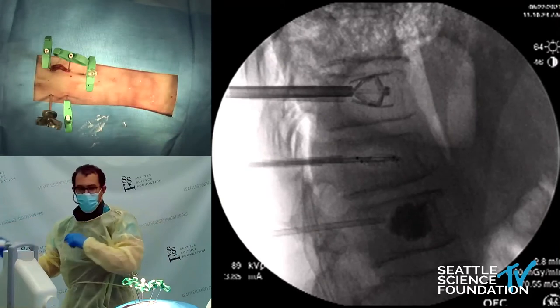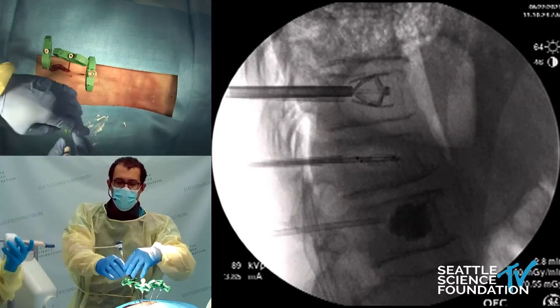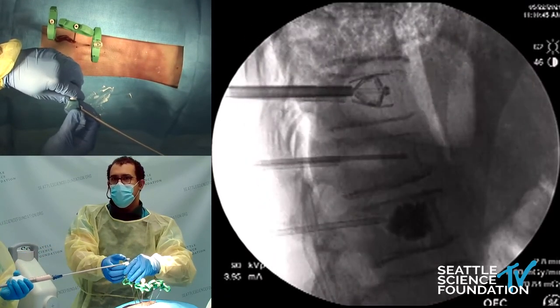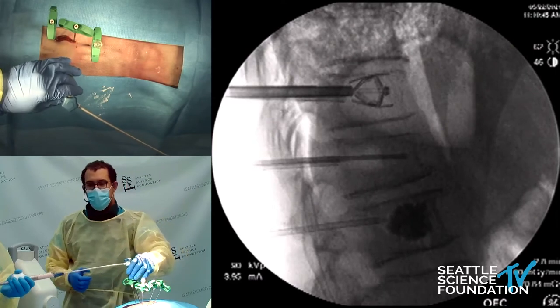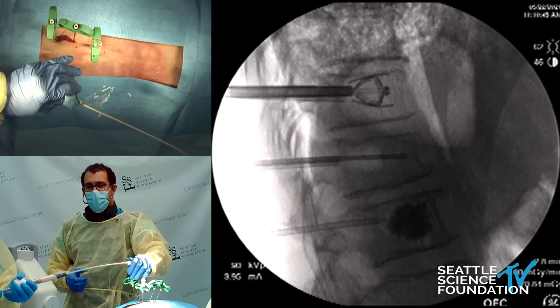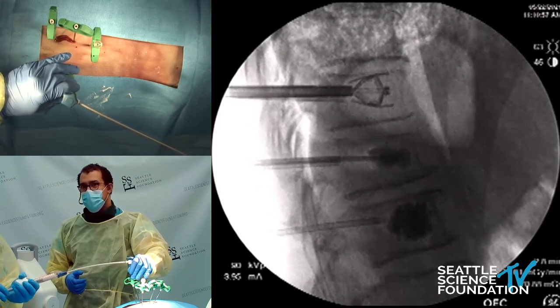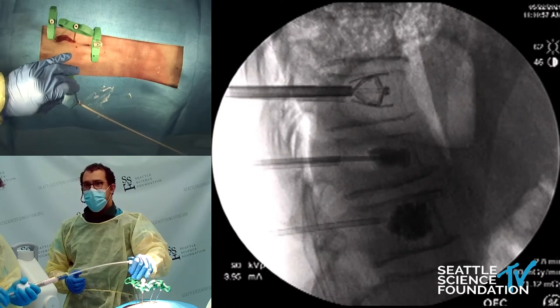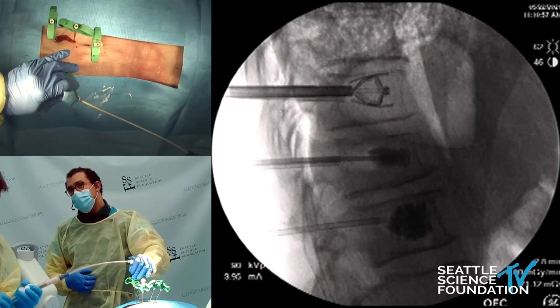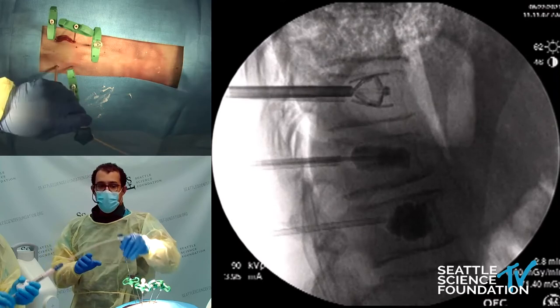We've got more cement here. We'd start on this side because we've got a nice trajectory, and you're right up towards the front where we want to be. You'll kind of want to match that fill that you saw with the kyphoplasty balloon. That's plenty on that side.